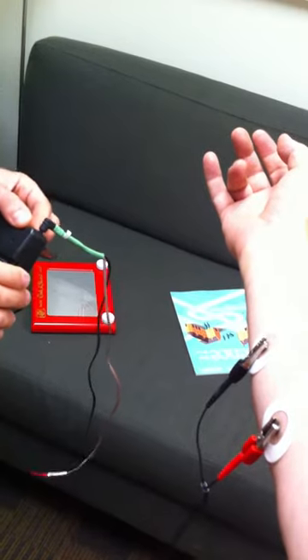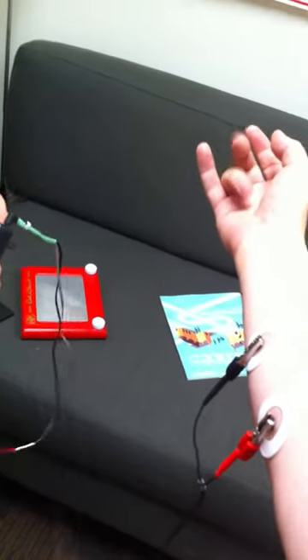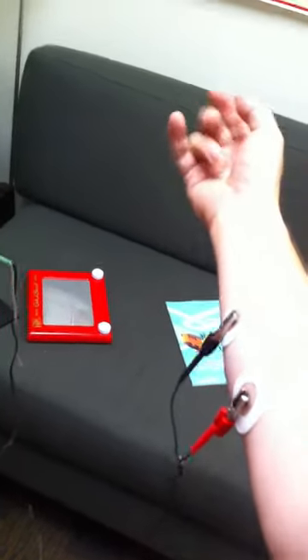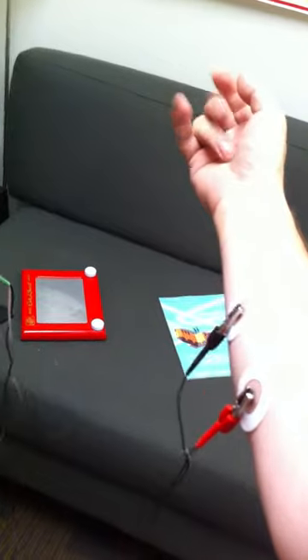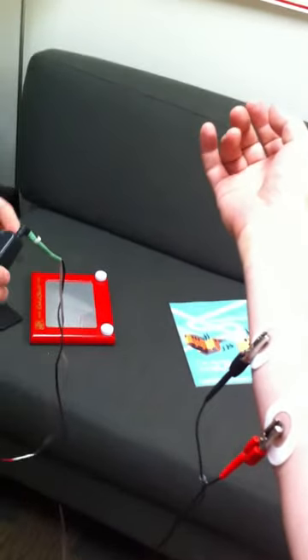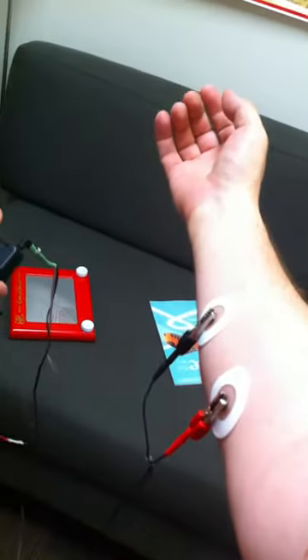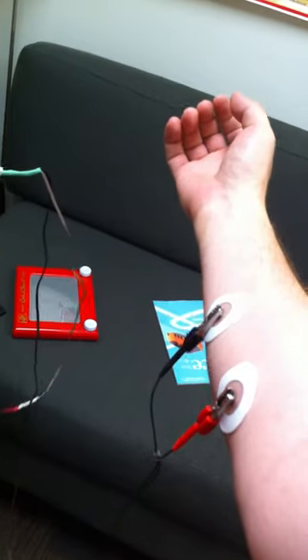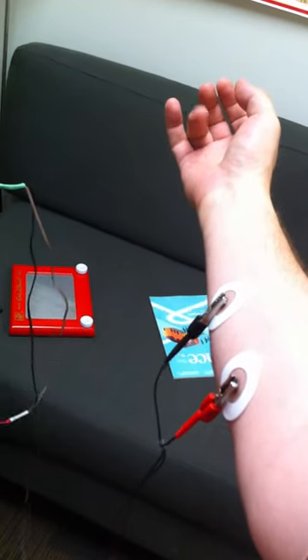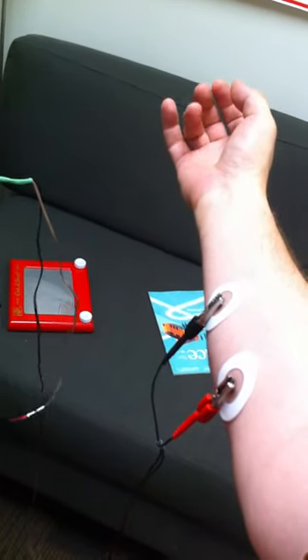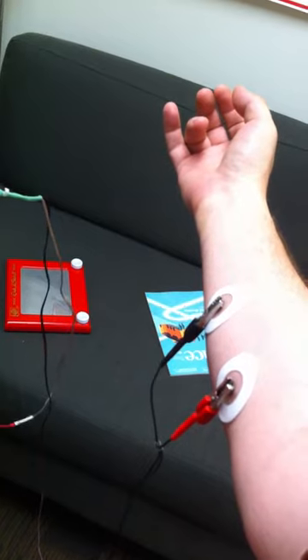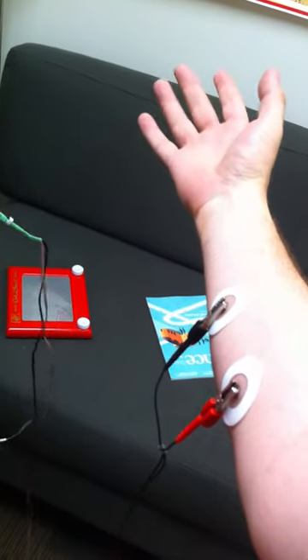So... would you say turn up the strength? Bastard. Okay, turn it down. Are you trying to fight it? No, no, I wasn't. It was just stinging a little bit. Wow, it's amazing how a 9-volt battery can make you feel like... It doesn't take much.